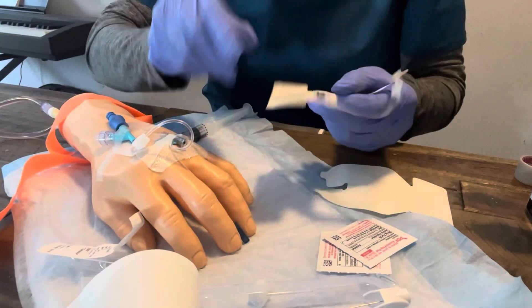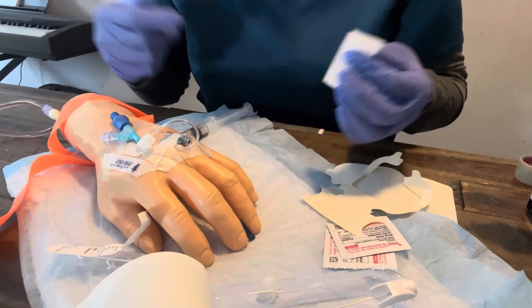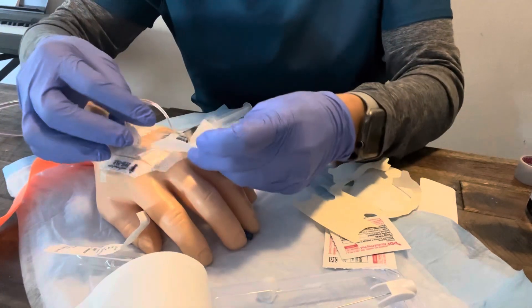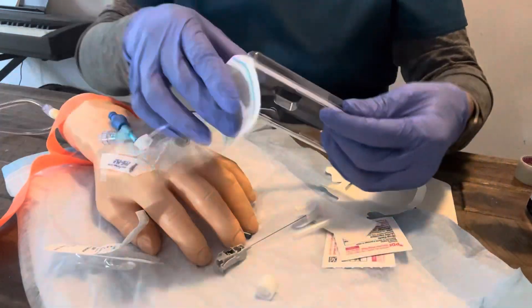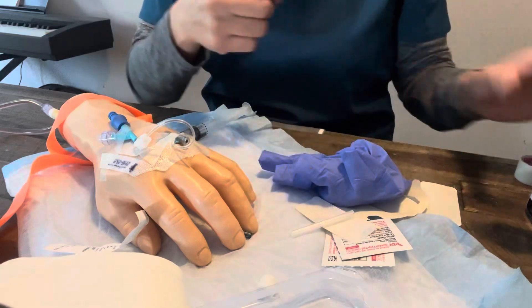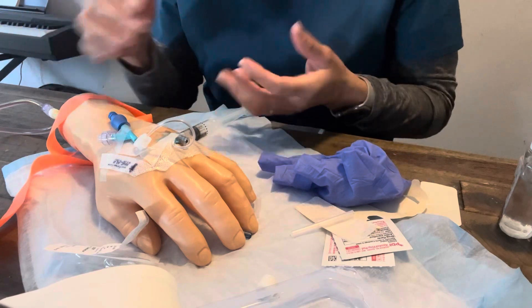I have my label here — date, time, initials. I'm not only documenting on the site itself but also in the electronic health record. I would document: date, time, initials; inserted a 22 gauge into the left hand; no pain, no phlebitis, no infiltration; patient tolerated. You can add extra securement if needed. That's basically how you would insert an IV with the Nexceva catheter. Discard your sharps, assess your patient again, make sure they need nothing before you leave, doff your gloves, discard all supplies, perform hand hygiene, ensure the bed is locked and lowered, and confirm orders if you need to do something further with the IV.